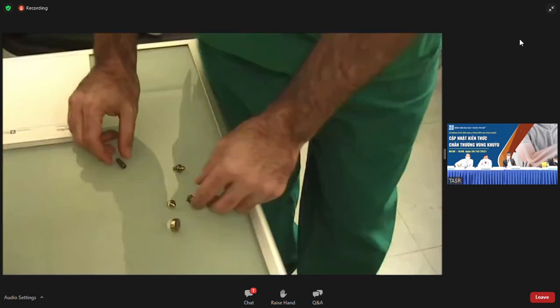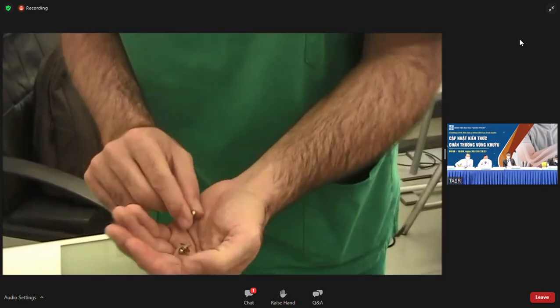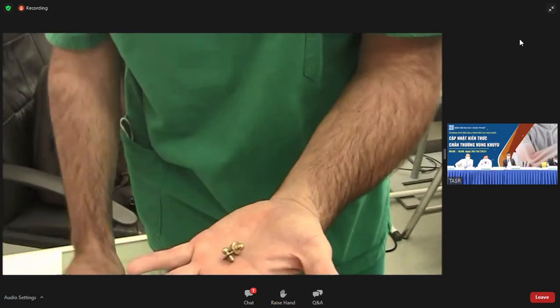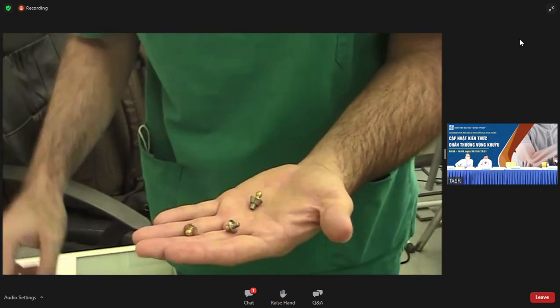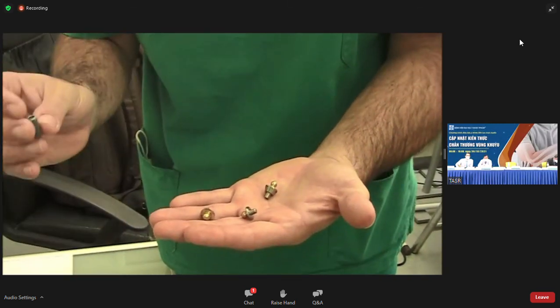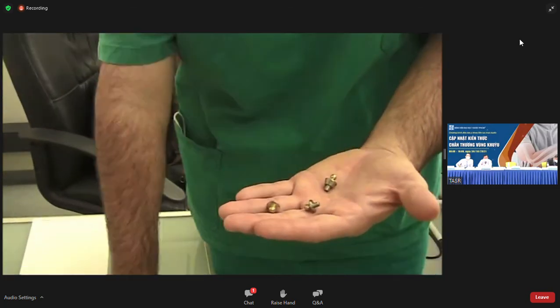Then there are the collar necks. These ones are quite common and don't represent anything that is completely different from what is known in the market. Those collar necks can be mounted over the prosthesis when you do the operation. And in general, they give 10 degrees of freedom to the head that is free to move.